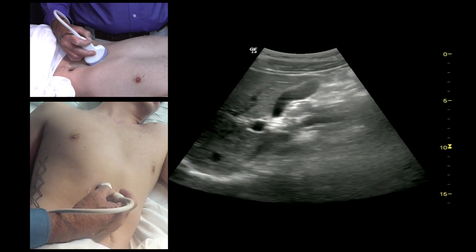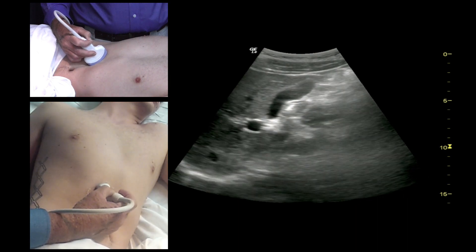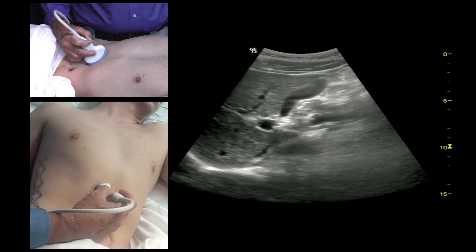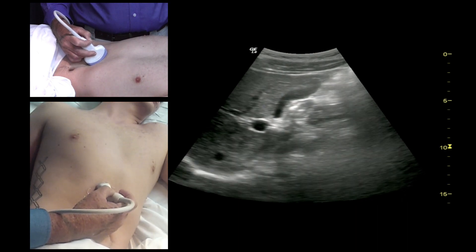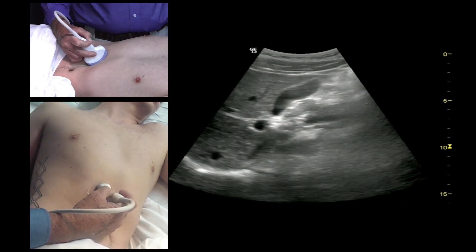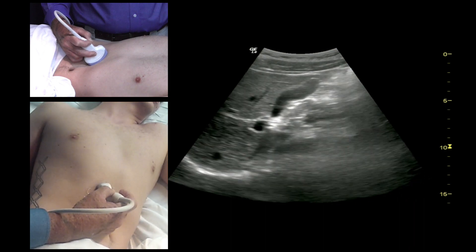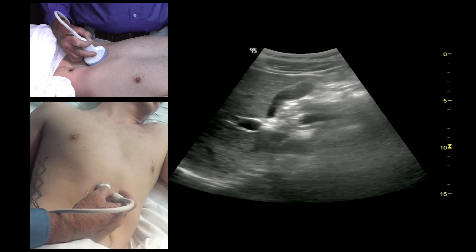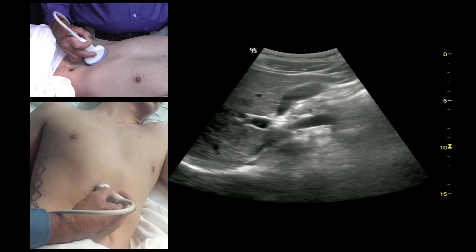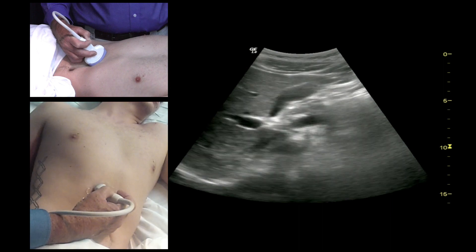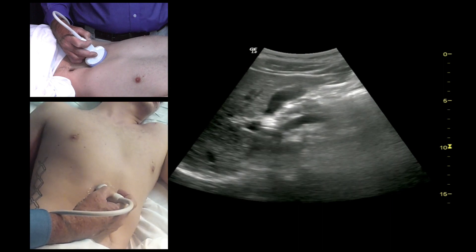You can slide back and forth until you get a nice longitudinal view of the gallbladder. Here you see not only the gallbladder, but you see the portal vein underneath it. If you look carefully, you can also see the common bile duct.